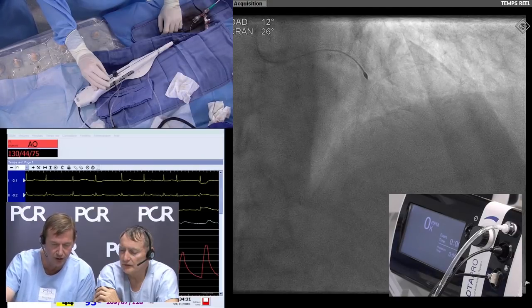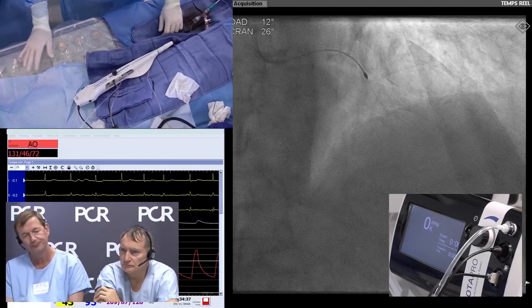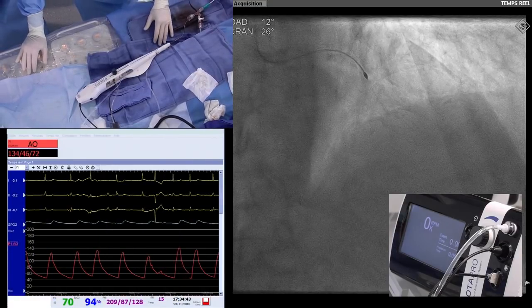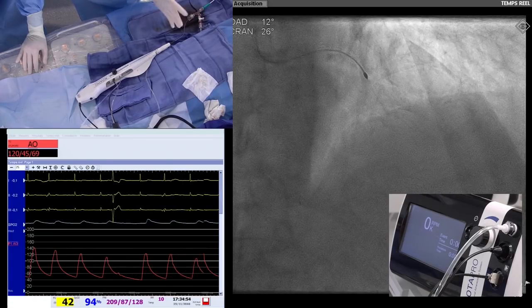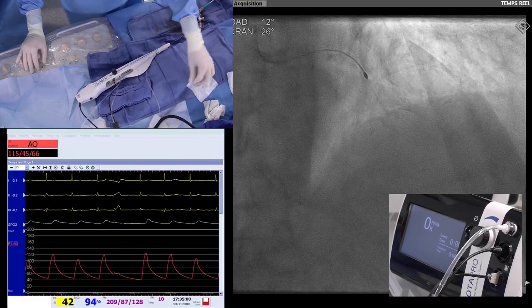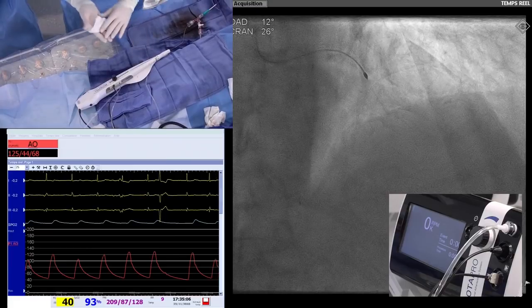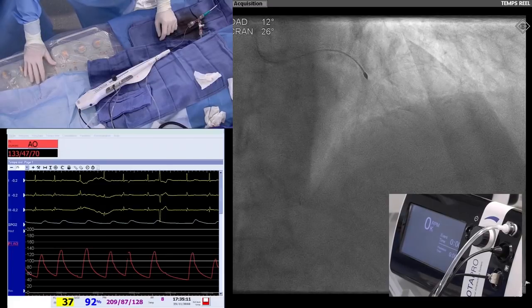Perhaps, Didier, you could answer. There's been a question about whether or not a pacing wire should be required in a case such as this. Okay. We stopped pacing the patient maybe 4 or 5 years ago, maybe more, because finally it's very short. We perform a very short rotablation, 10 seconds, sometimes 15 seconds, no more. We wait, and if needed, we can inject atropine. I will only recommend pacing for patients with heart failure, maybe left ventricular ejection fraction at 20%.